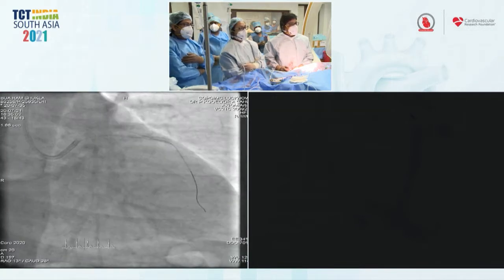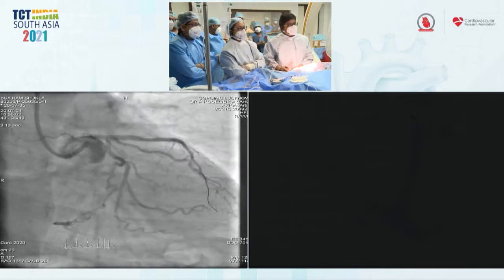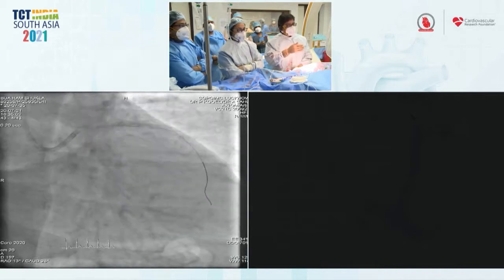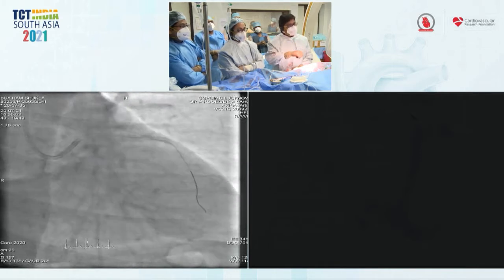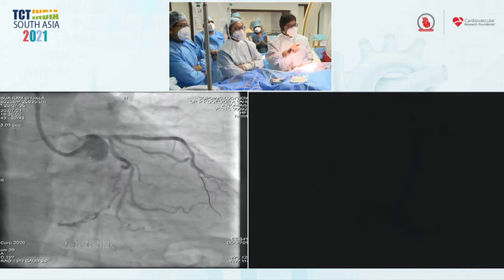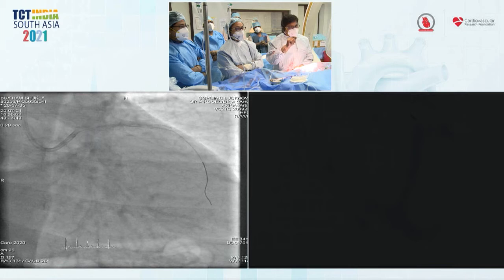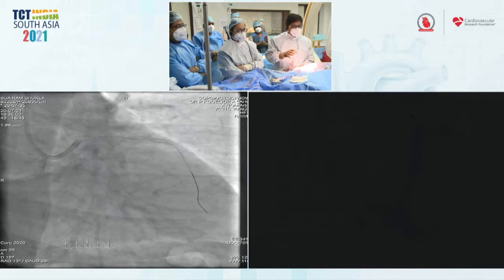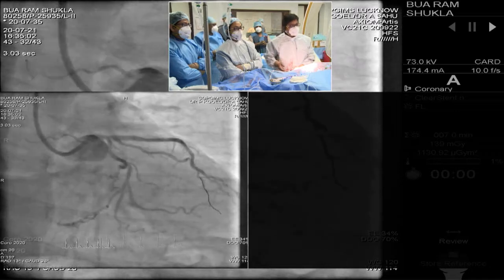Last angio, yeah. I just wanted to, so this looks like it was done only a week or so ago, correct? Yes, correct. Just a week ago, with the thought that maybe some septal collaterals could grow and the patient would be more stable now. You see, because now I have an opened LAD, so when I'm doing the RCA, I'll have a more stable patient, and that's one of the reasons we did the LAD first, and especially because the LAD was part of the culprit, because the flow in the LAD was really subtotal, and that is the situation which is more responsible for the worsening which had happened in the last 6 months to year maximum.